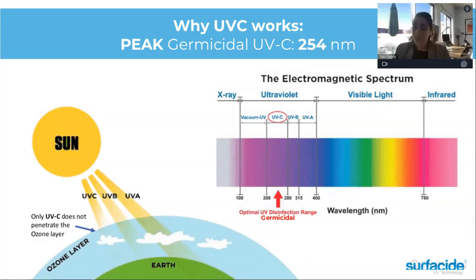So if you're within that 10-foot area, which most of your operatories are, and if they're smaller than that, even a 5-foot area, you're looking at 2 to 3 minutes. On the long end, you're looking at 5 to 7 minutes. And if you have a reason, like a patient you know is COVID positive or something like that, maybe you want to give it 10 minutes. But it's going to be able to get that 6 log reduction in that timeline. Again, it just depends on the space that you have.